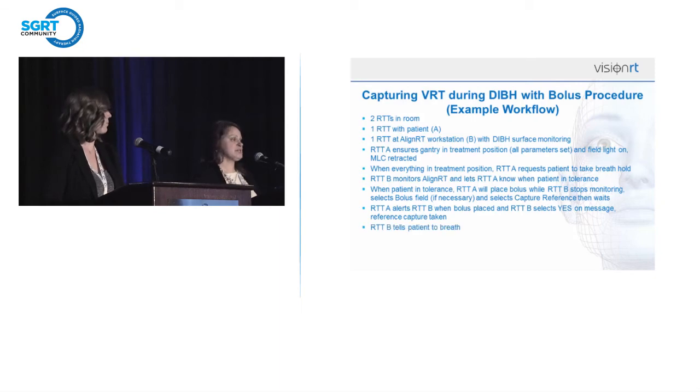Therapist B will then tell the patient to breathe, and therapist B will ensure that there is an adequate ROI on the new reference surface. And we're going to continue monitoring then for our treatment with that new VRT surface, but only for today.